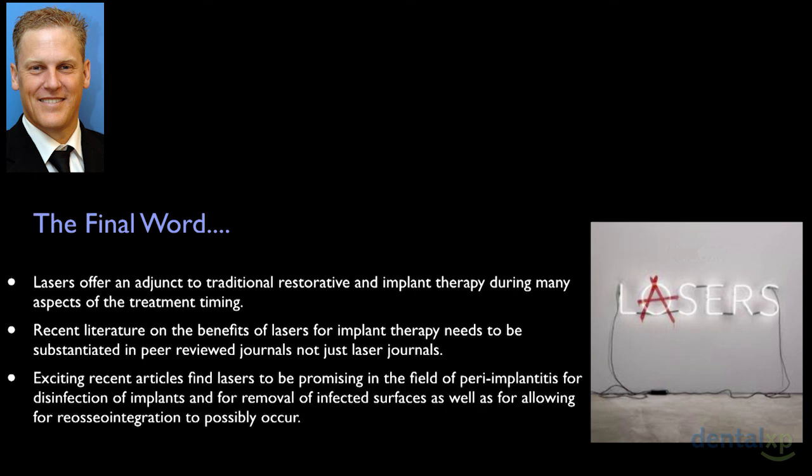And in addition, there's exciting recent articles in IJPRD that shows that lasers are perhaps very promising in the field of periimplantitis for the disinfection of implants and for the removal of infected surfaces, as well as for allowing for reosseointegration to occur. This has been one of the highlights of my professional career.